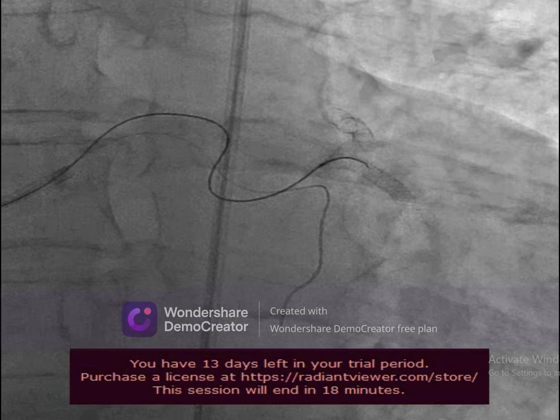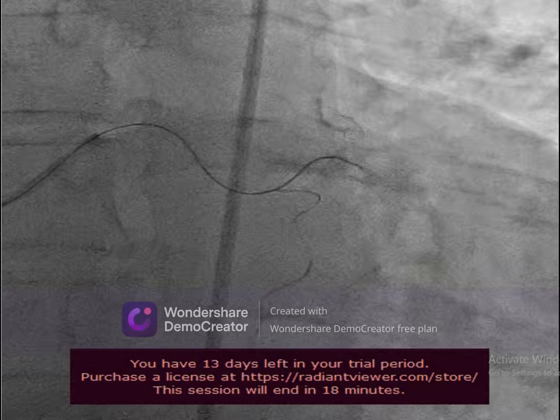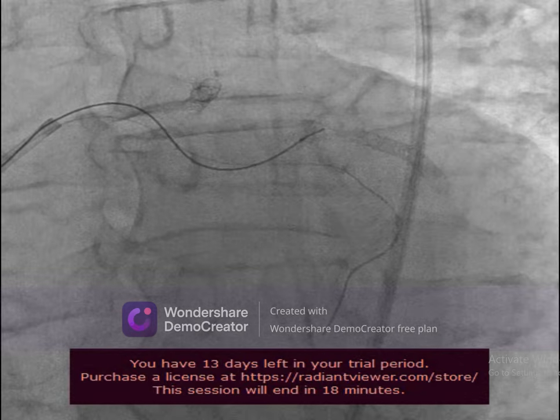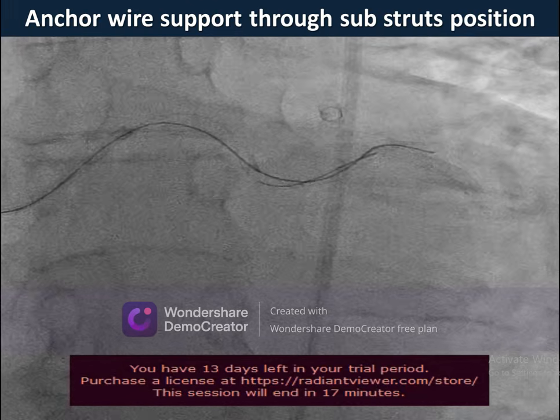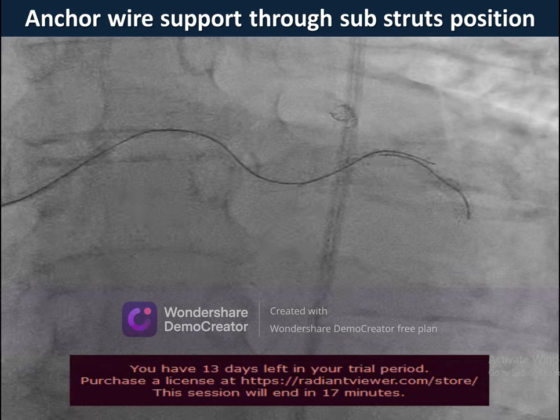I changed the wire again to the Gaia Third, and I put the balloon over it, and as you see here, several trials again and again. I took other projections to see if I was inside the pathway or not.